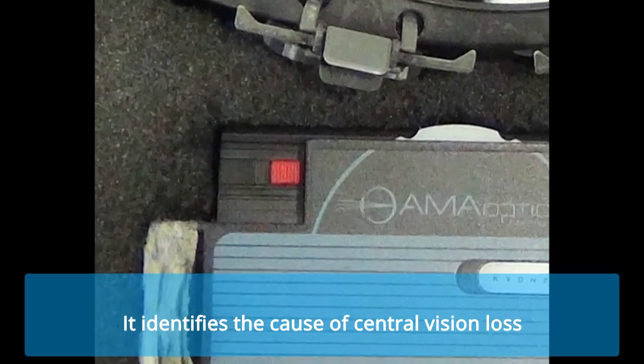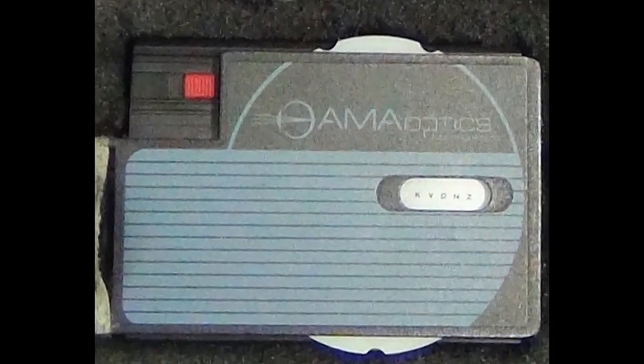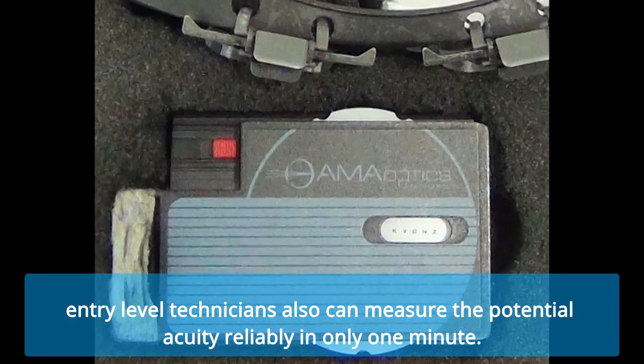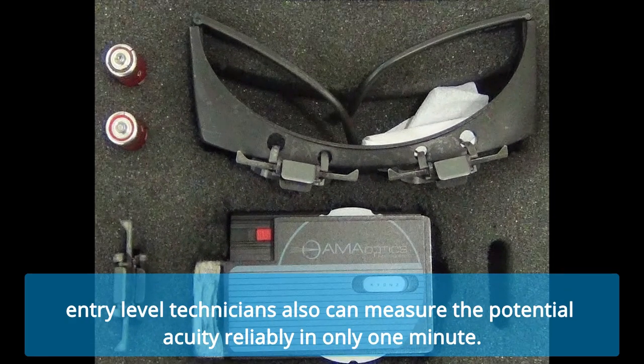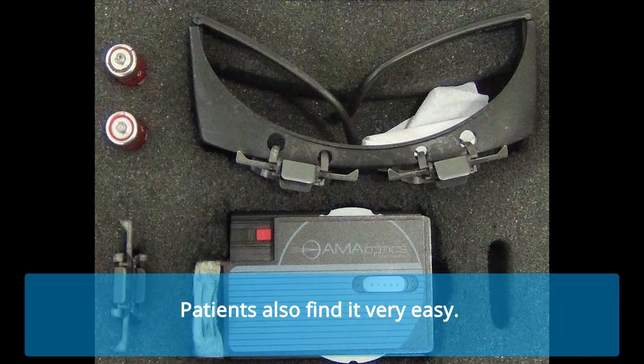It identifies the cause of central vision loss. It is so simple that entry-level technicians can also measure the potential acuity reliably in only one minute. Patients also find it very easy.